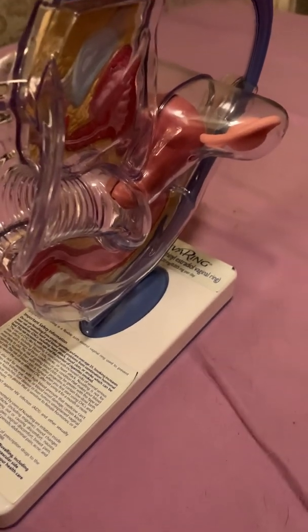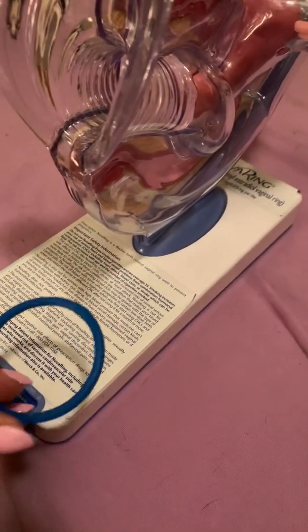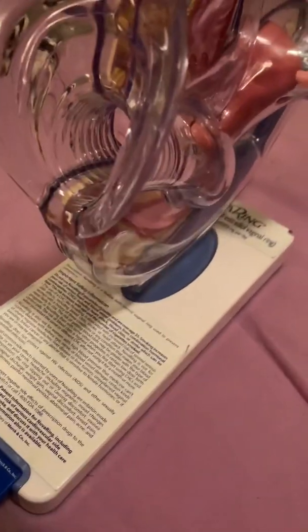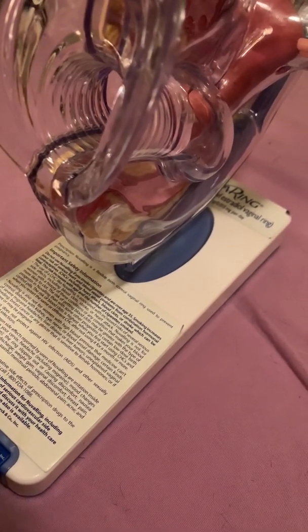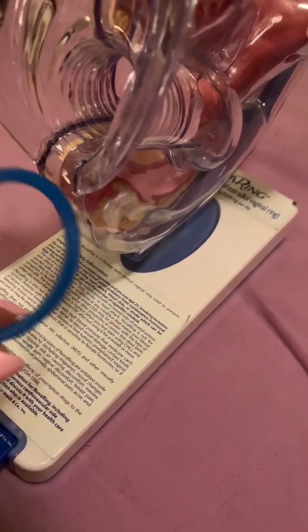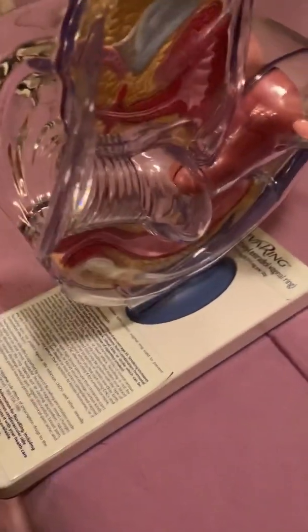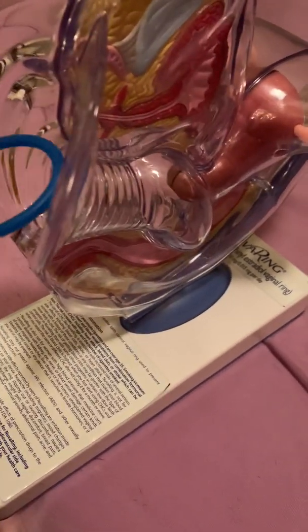This is a simulation of the NuvaRing. This may not be applicable for some women. Some women may not have the flexibility; they may not have the initiative to touch their bodies in a manner like this. But basically, it goes into the vagina.